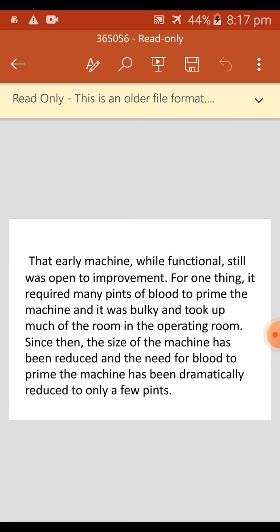Today, most membranes are made of polypropylene or polyethylene and permit operating times of 6 to 8 hours. The oxygenator must be able to oxygenate about 5 liters per minute of venous blood from 65% oxygen saturation to above 90% oxygen saturation before the blood enters the body systems.